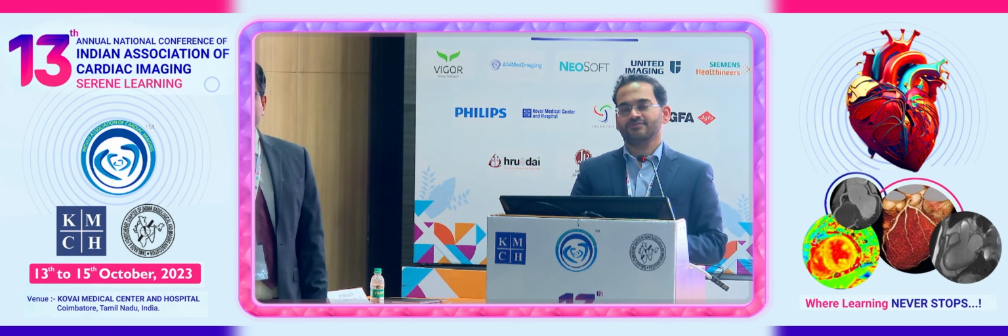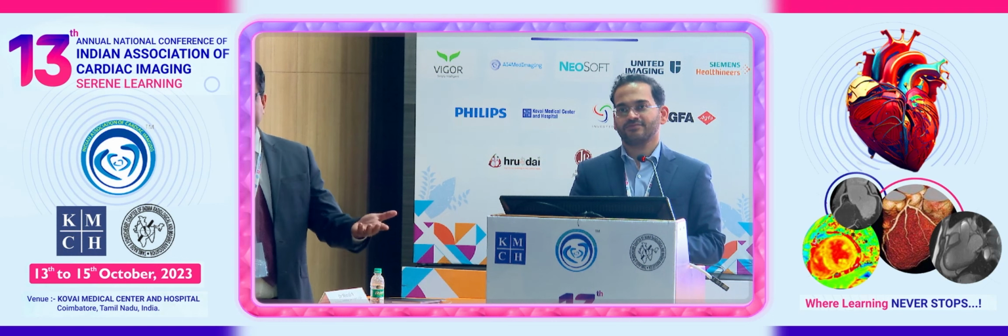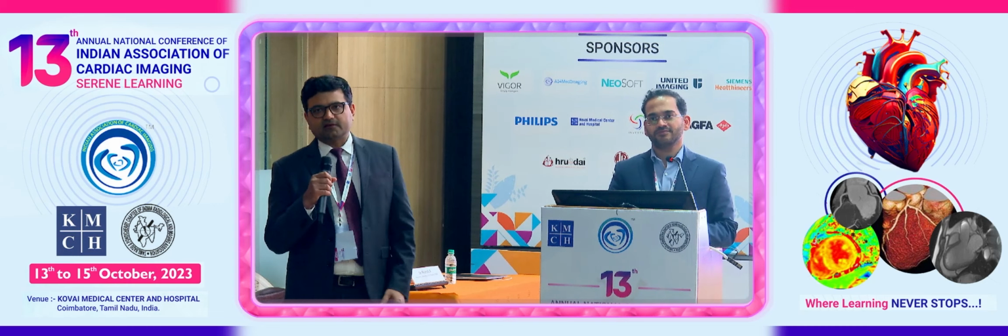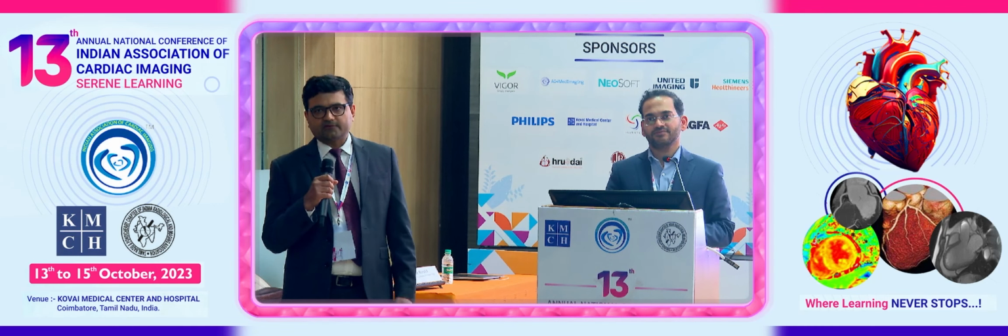Yes, you can quantify it. With software, you can segment the right ventricle in both systole and diastole, and you can get EF and volume and everything. Yes, you can do that.